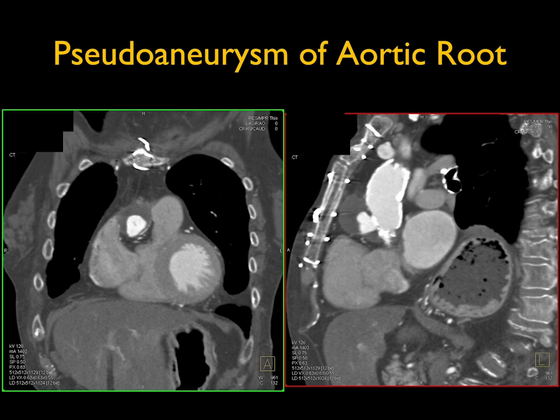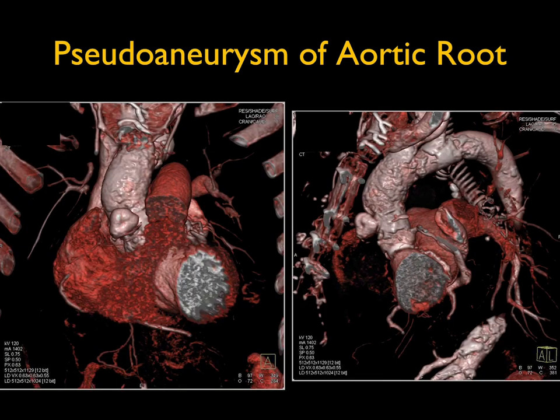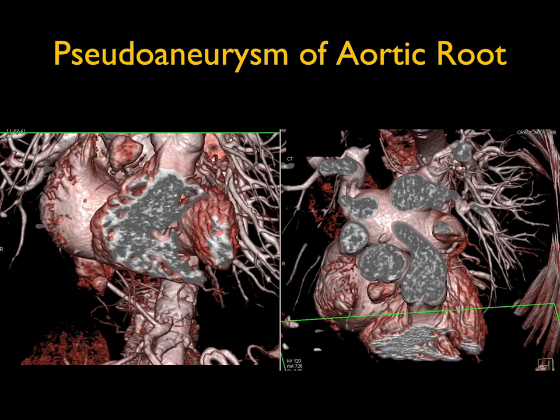Pseudoaneurysms can occur at trocar sites, at sites of surgery, and in patients who've had ascending aortic repair or valve repair — not an uncommon complication. You need to be aware of these because they are concerning for the possibility of rupture and bleeding, so patients will likely need surgery. It is very nicely shown on the cinematic and volume rendering — a real nice example of that outpouching through a range of projections.